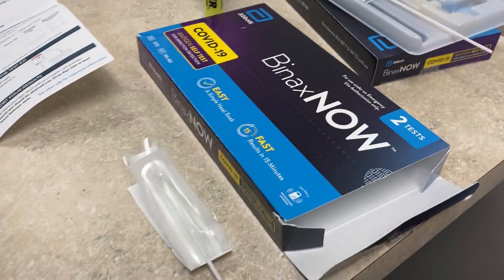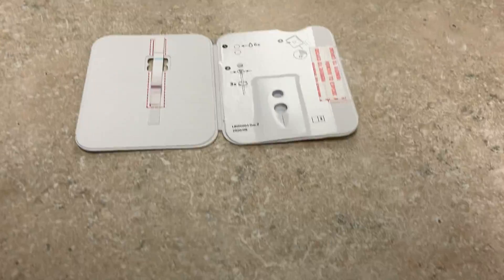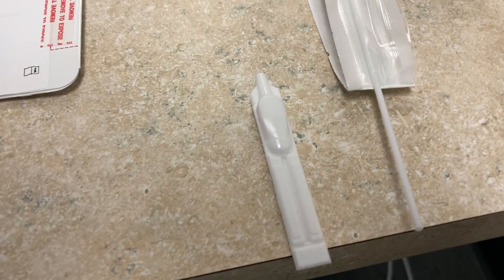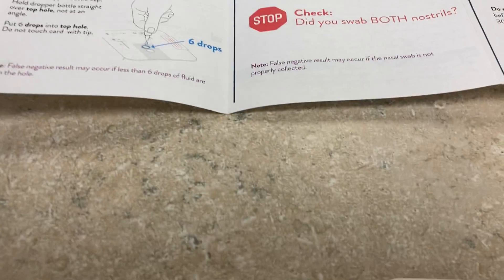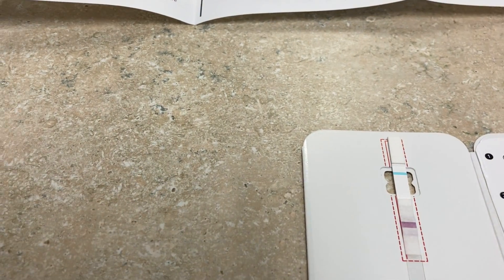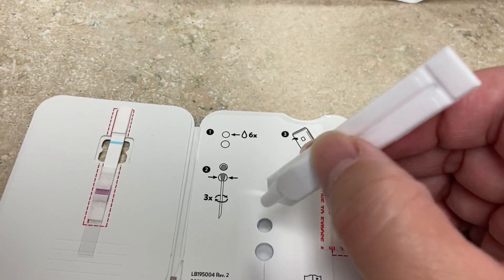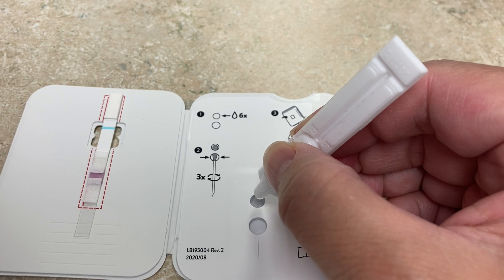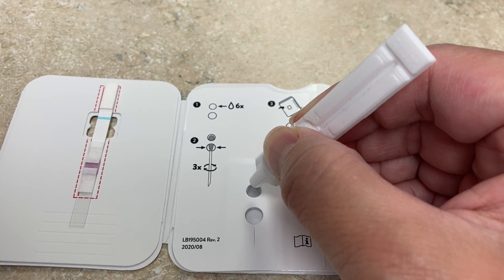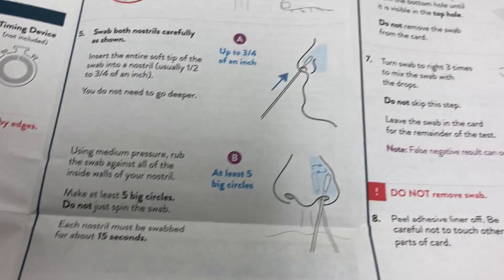I'm doing an Abbott BinaxNOW test to see what the status is. The test kit has some solution and a swab. According to the instructions, the first thing you want to do is put six drops into the top hole: one, two, three, four, five, six.